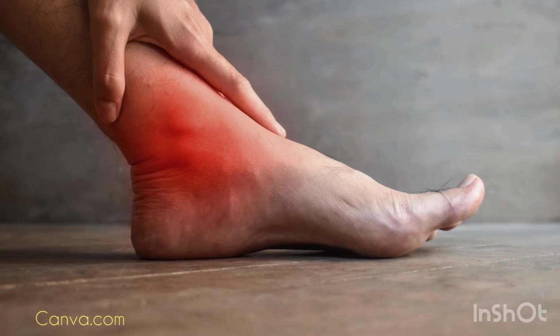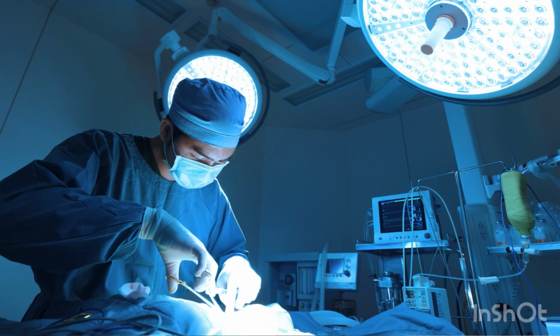Correct positioning allows the physicians to identify fractures, ligament injuries, or joint abnormalities. The X-rays help the radiologist determine whether the patient will need surgery or not. So positioning ankle X-rays correctly is essential. As a student, remember that good positioning equals diagnostic images, and mastering this early will make your clinical rotations much smoother. Next, let's talk about the standard ankle X-ray views that every student must know.